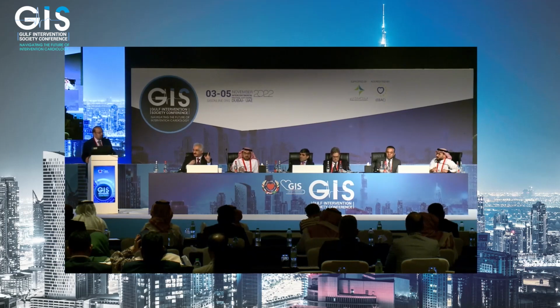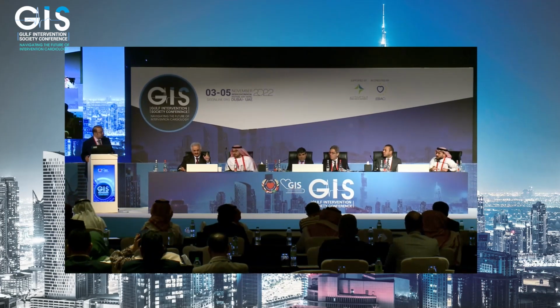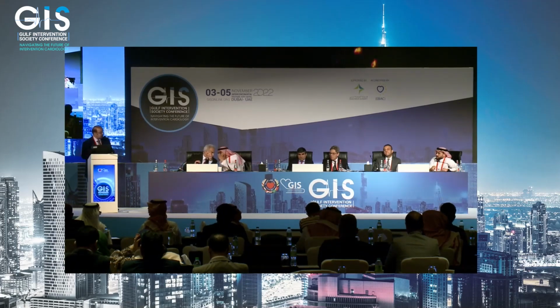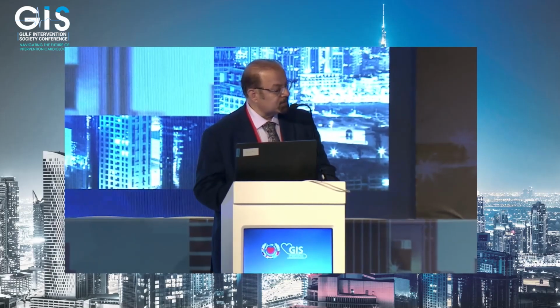Just what's the status of the medication? Because it's more or less a thrombus on a fractured stent that has been there for a long time. Yes, this is the typical presentation of very late stent thrombosis. The patient had marked and significant hyperplasia, and then the hyperplasia induced thrombosis after that.